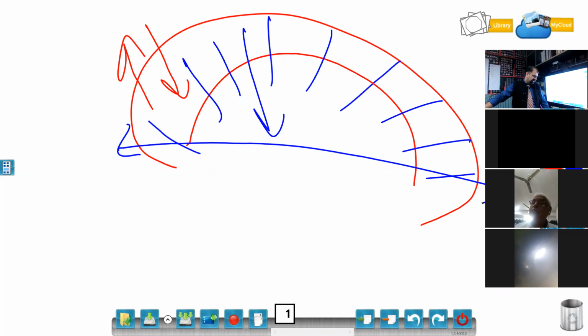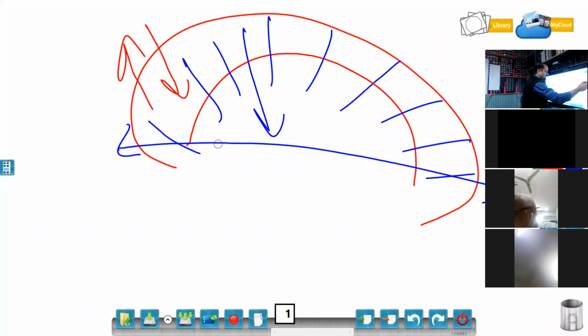Now what is left? Renal abscesses. The abscess looks the same, be it in the liver, the kidney, or the spleen. There are phases of abscess. Abscesses don't have clear contours, they have irregular contours, and towards the end the echogenicity drops. The concept of the abscess is the same. Whatever is discussed with you, yes, there can be renal abscesses also. Okay, so these are the important points you have to remember about the kidney.